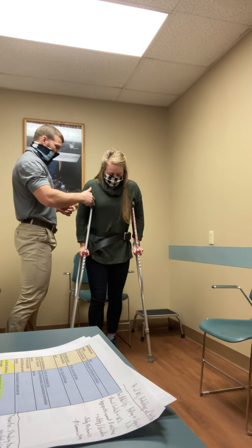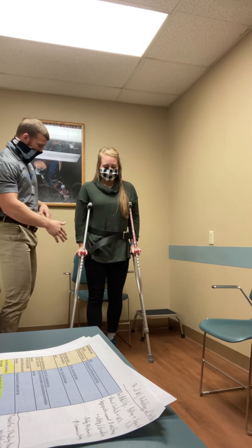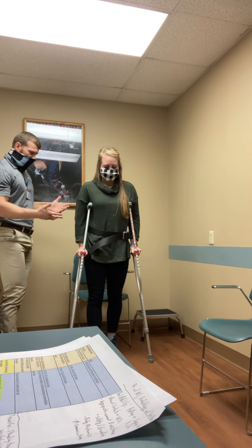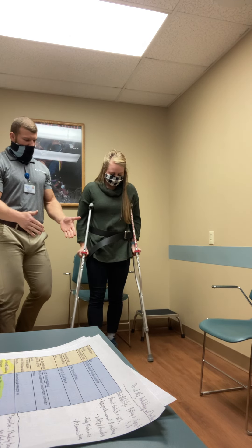Like I said before, about two inches underneath the pad from your axilla — very nice. A little bit of an elbow bend, about 20 to 30 degrees. Looks pretty good. So let's go ahead and work on that step-two gait pattern.